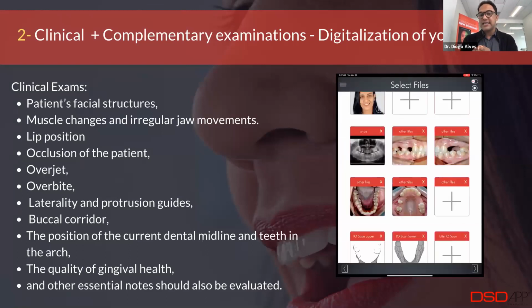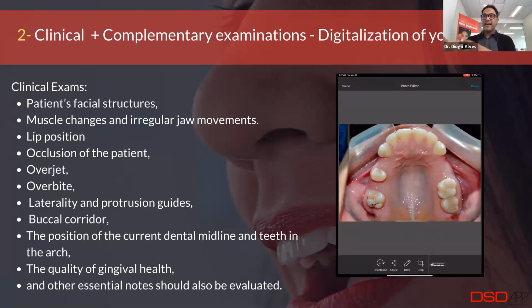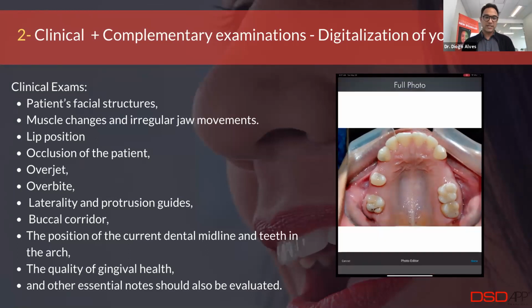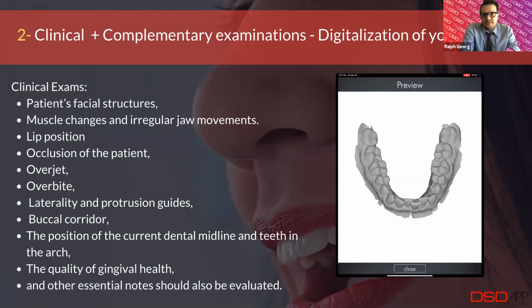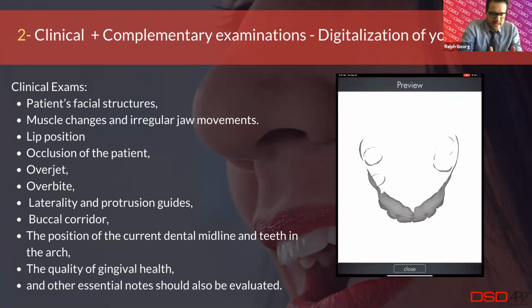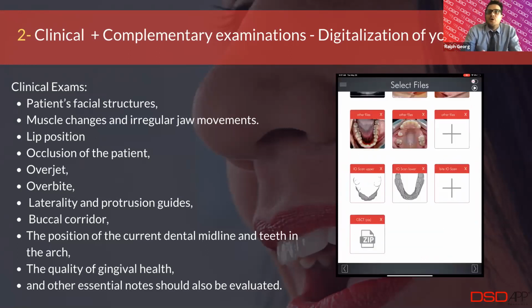One of the greatest things is that you don't just have those patients for yourself, because you can export all of those documents into one file and share that with your dental technician or with other specialists also working on the project. And you can add your notes into it, which is great. Normally, what doctors have to do, and I'm sure there are a lot of doctors in this room, is go into Dropbox, look for the file, get it out of Dropbox, throw it in there, and then go to their server, log in, and pull up the images.